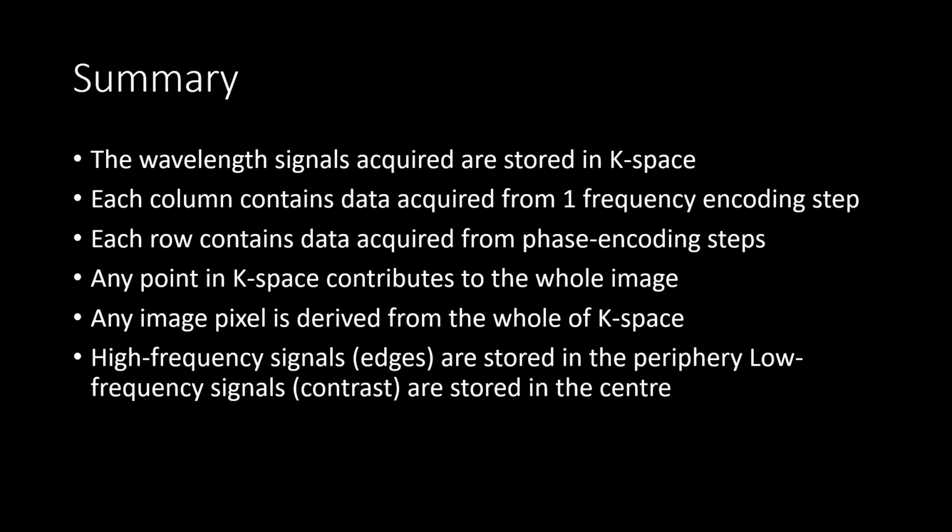Based on this, I explained the K space, but I also tried to include slice selection, the phase gradient and the frequency gradient in this section. But those are separate topics. So please go back and see those videos either from radiorai.in, or you can contact me. I can take classes again if you are interested.